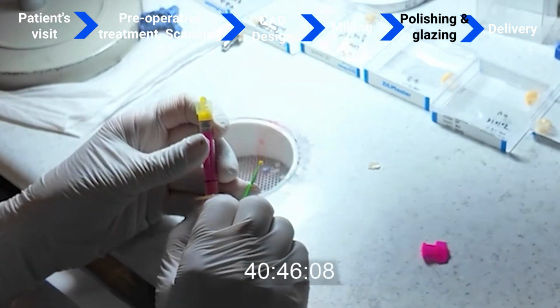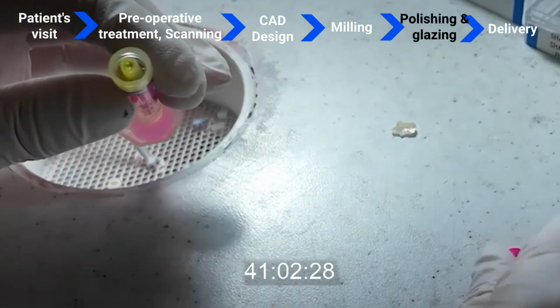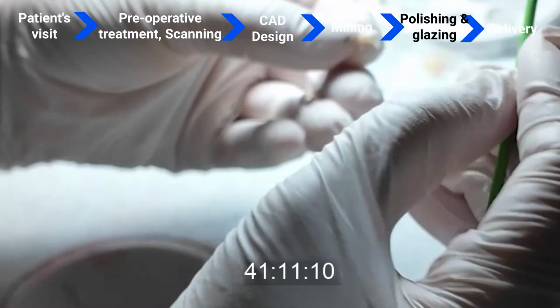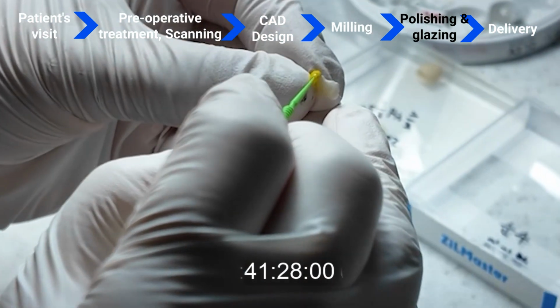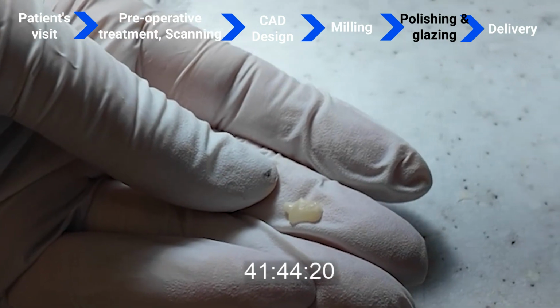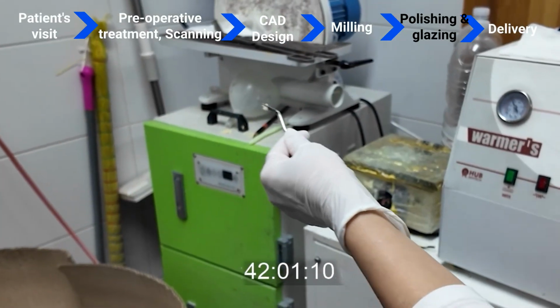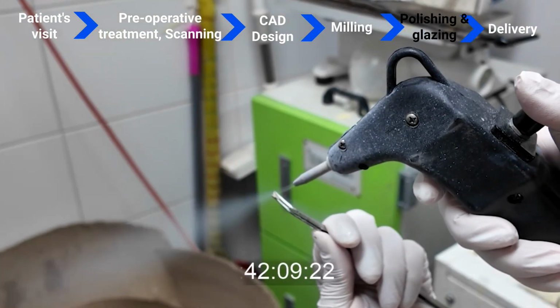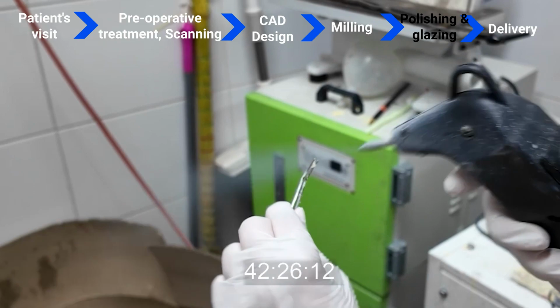After polishing, we wash and apply hydrofluoric acid to the inner surface. A quick steam clean and drying, and our inlay is almost ready.